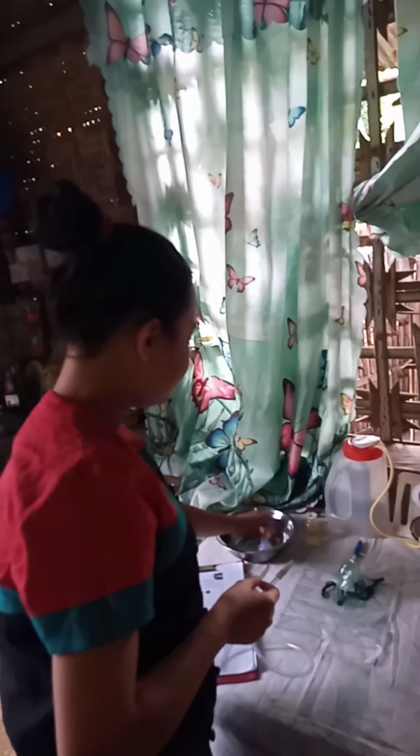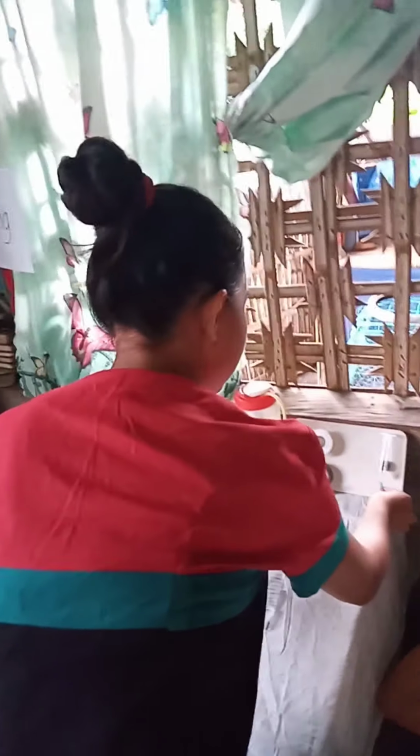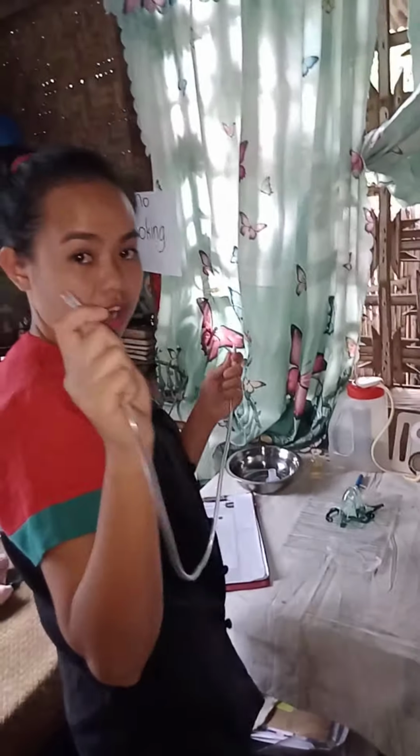In this case, we need this oxygen adapter attached here to the flow meter. Then after that, we need to attach this oxygen tubing.